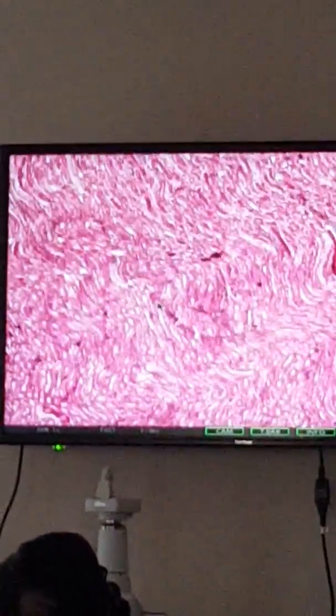So this is medulla. I bumped it, and I'm off in the medulla again. Oh, here's the cortex. Okay, so we pointed out the cortex and the medulla. We saw an arcuate artery. Now sometimes what we like to do is just look around. Let's put this one right here in the middle. And let's see if we can look at it at a higher power.